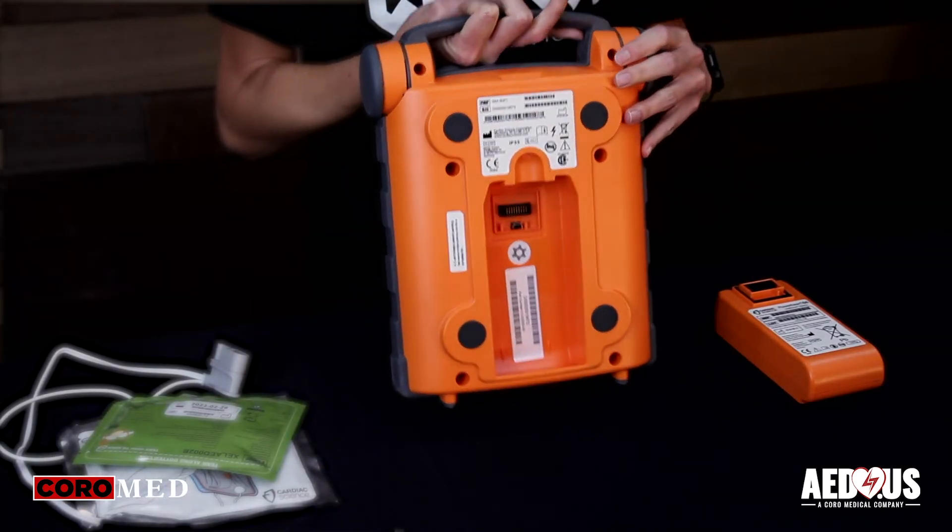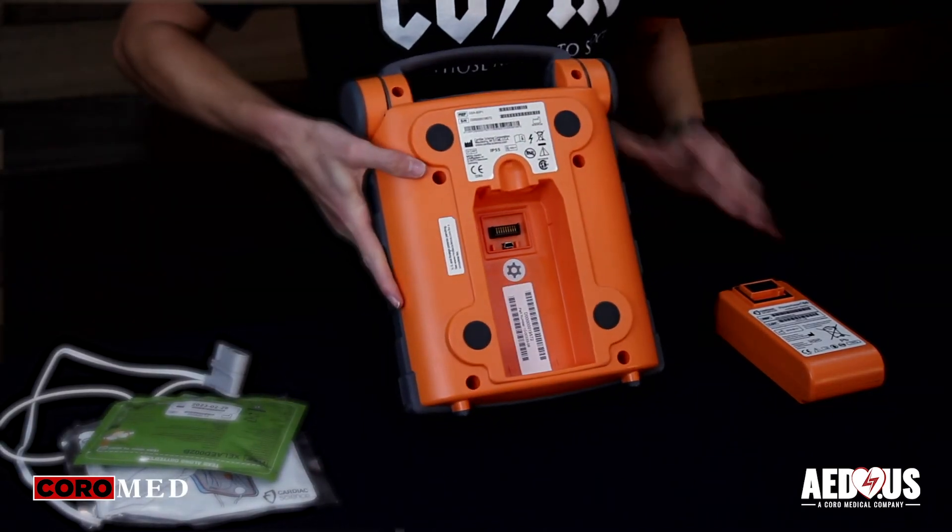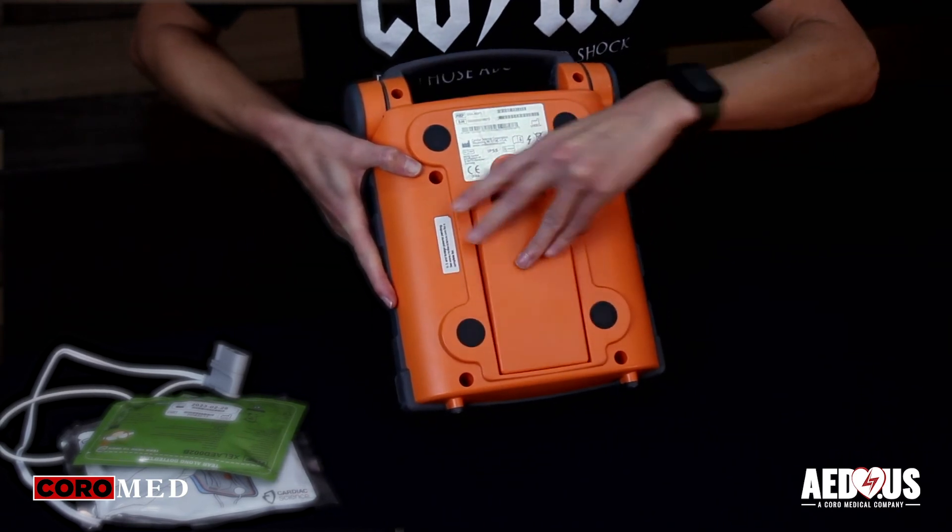To install the battery, turn the device over, take out the old battery, and put the new battery in until you hear it click.